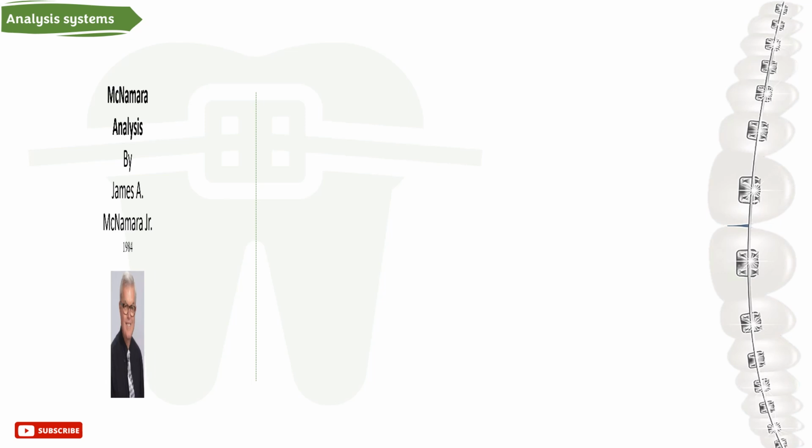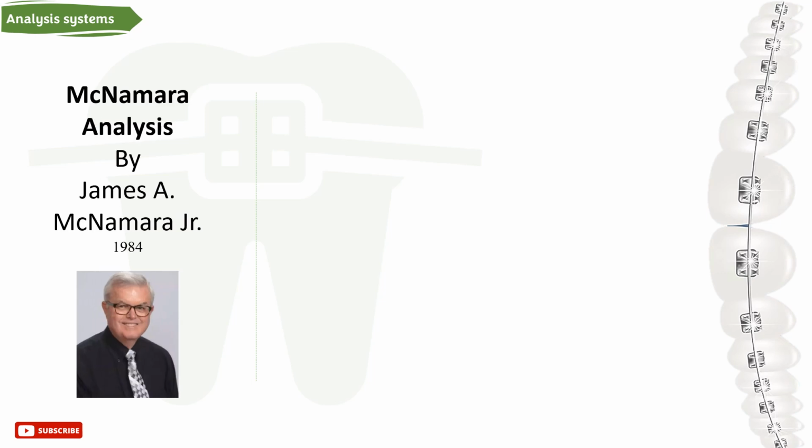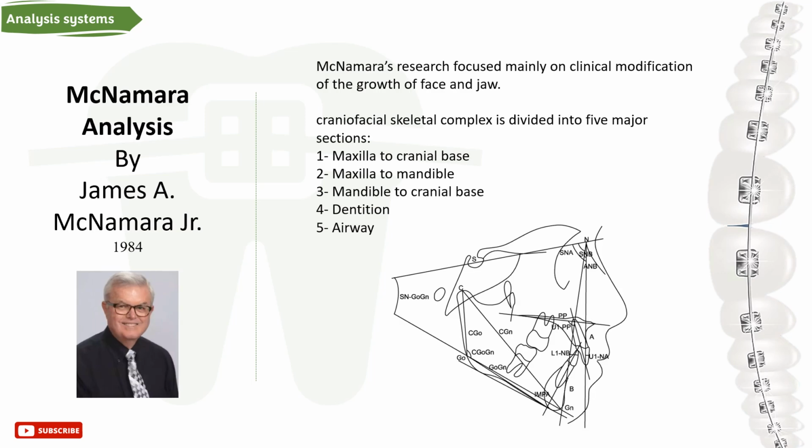McNamara analysis. McNamara's research focused mainly on clinical modification of the growth of face and jaw. The craniofacial skeletal complex is divided into 5 major sections: maxilla to cranial base, maxilla to mandible, mandible to cranial base, dentition, and airway.